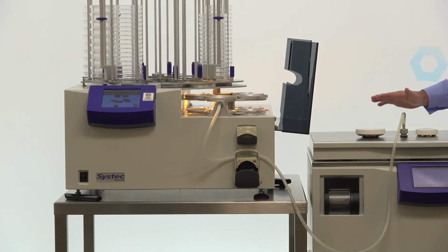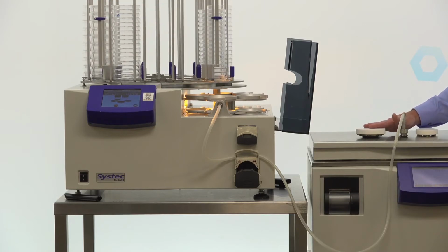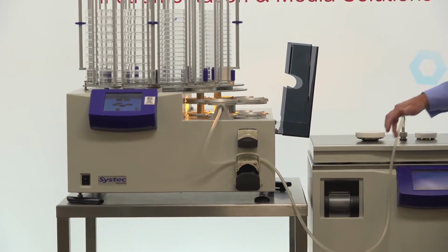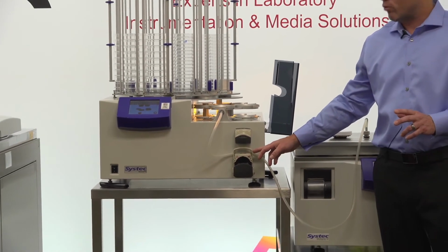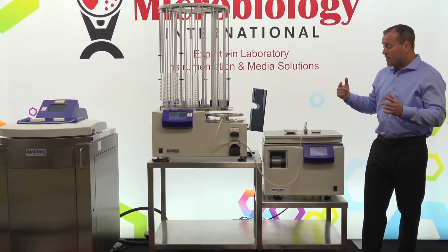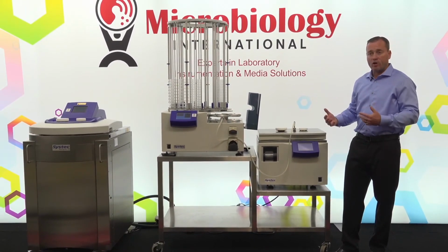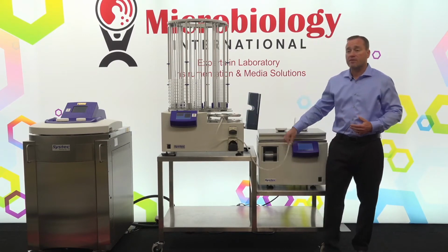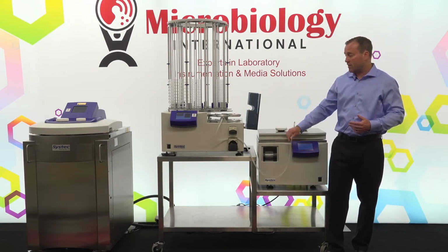So the temperature that we program in the MediaPrep to pause at is probably around 48. That gives us a lot of flexibility for losing any heat through the transfer process into the system. And then if we had any errors, we would be able to solve them without having media solidified in our tube.